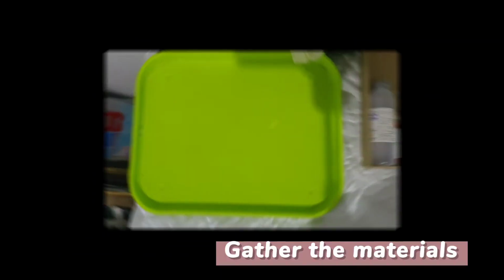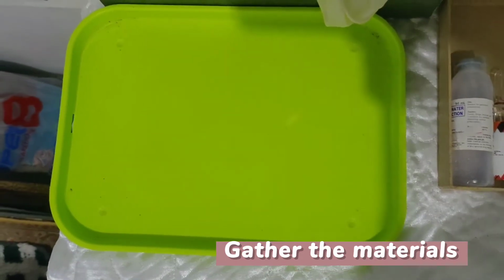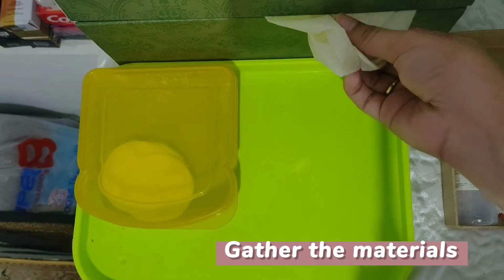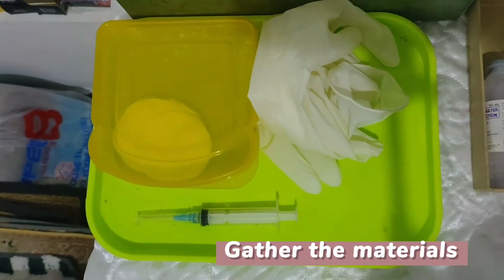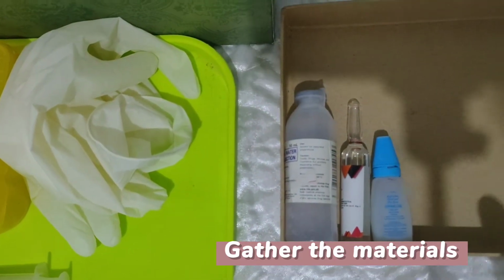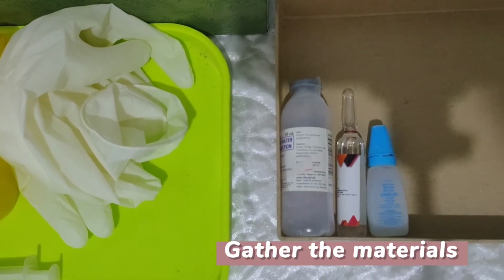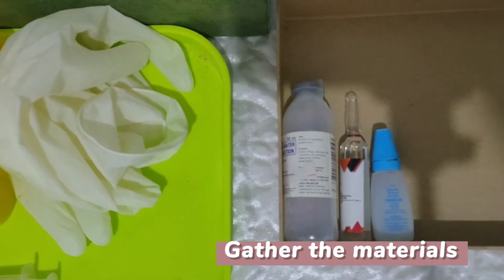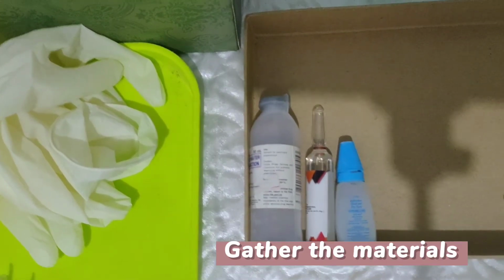After doing the hand washing, now we will gather all the materials that we need. So we need a cotton pad, a pair of gloves, and a 5cc syringe. Before that, we need to verify the right drug to be administered by reading the name of the medication from the record. I will assume that I have read it. Okay, so this is the medication.